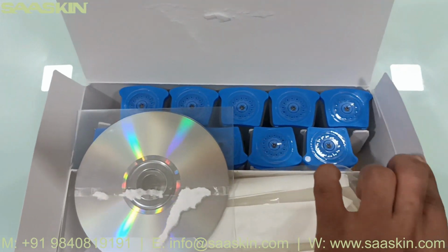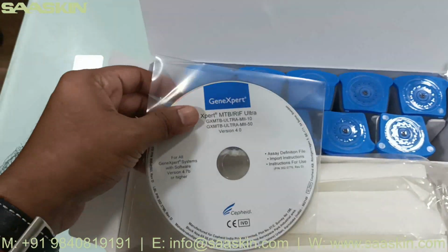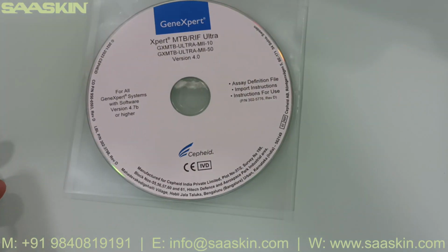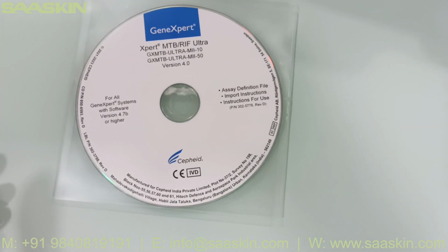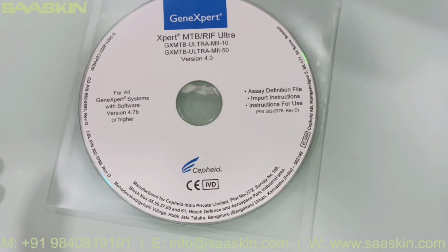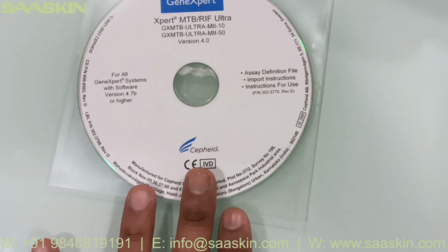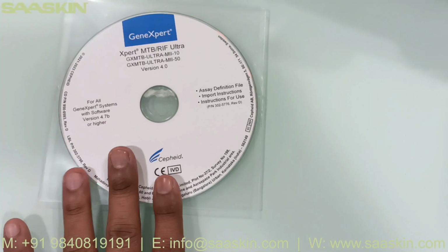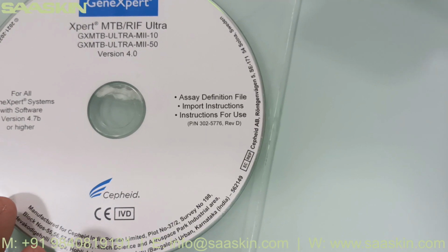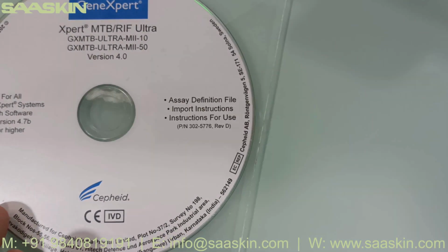So as you see on top, there is this GeneXpert MTB RIF Ultra for all GeneXpert systems with software version. This is one software. This is a device with a CD. It is used for assay definition file, import instructions for use.